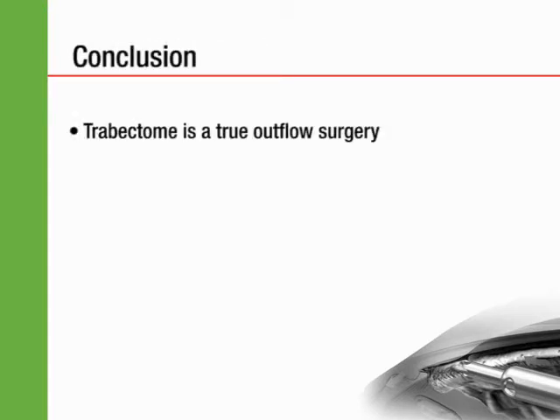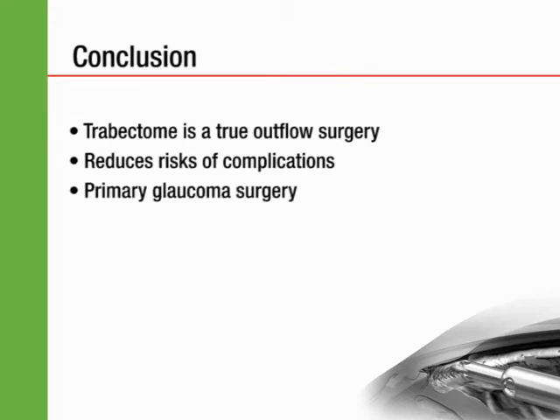In conclusion, we believe that the Trabectome is true outflow surgery, which is not relying upon external filtration. This reduces the risks of complications seen in external filtering surgeries, such as those related to hypotony or infection. We feel that this has a place as a primary glaucoma surgical procedure and has a great advantage of sparing the conjunctiva for future use.